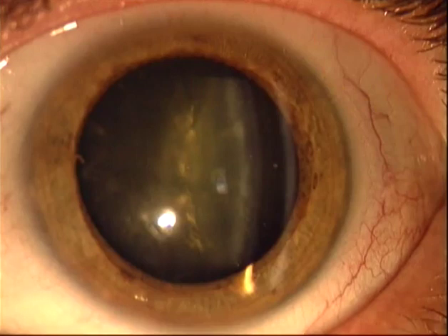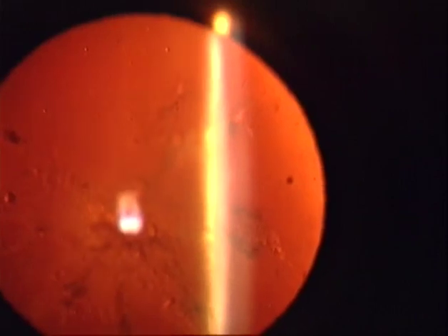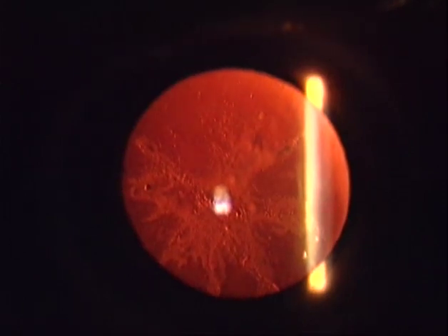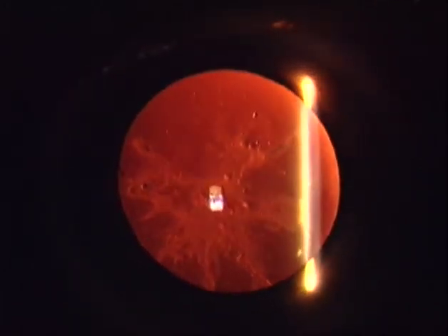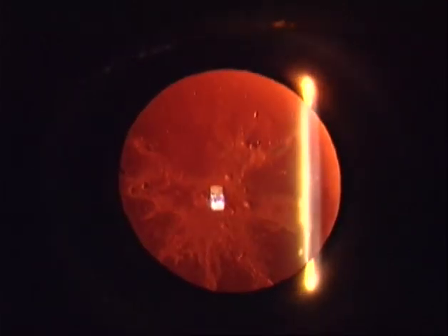How can refracting phenomena be detected, for example, in this case of anterior and posterior cataracts, when neither the existence nor the position of refracting lesions are known in advance? First, retroillumination is established. Then the area where lesions are suspected is scanned in its entire depth by moving the microscope back and forth. Small magnification is used because it has the advantage of the maximum depth of focus, which allows one to see opacities from many levels at one glance.